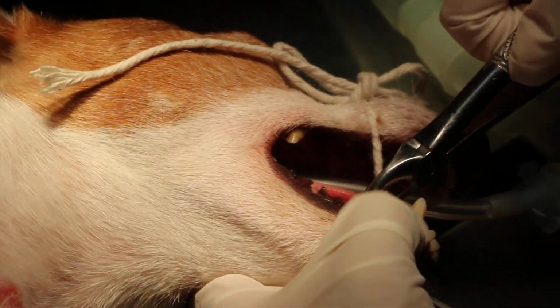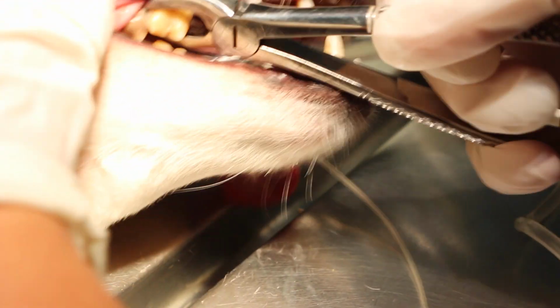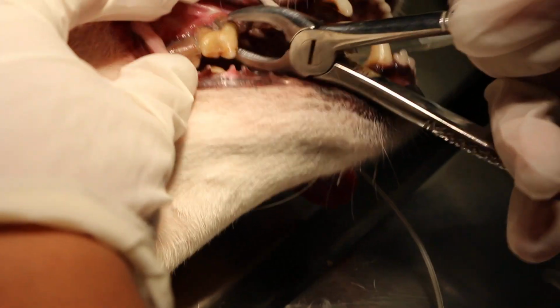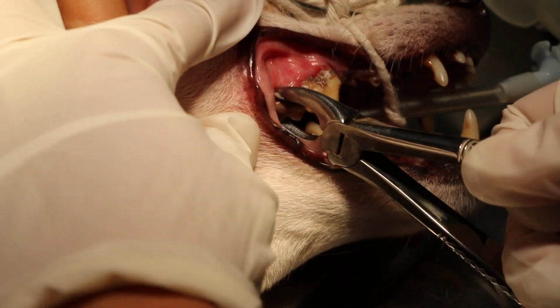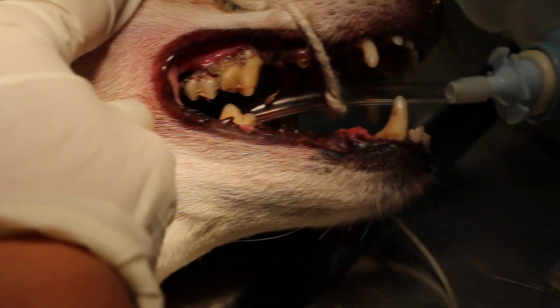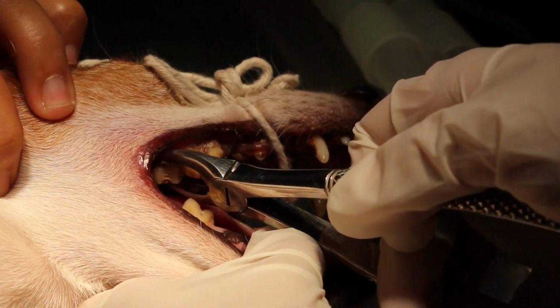So now we have given a low dose of sedation, and then after that we will crack the tartar first, and then after that we will check the tooth whether it's loose or not.